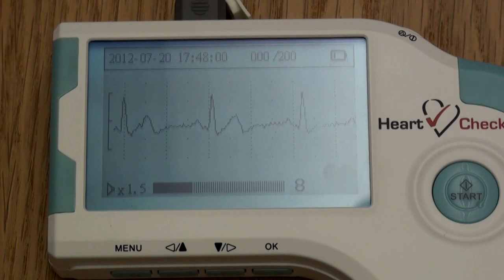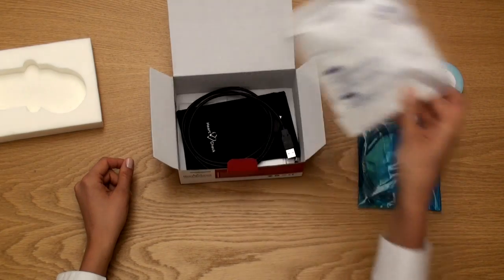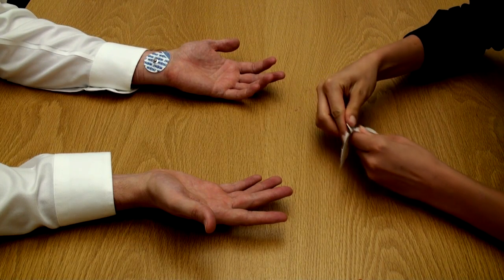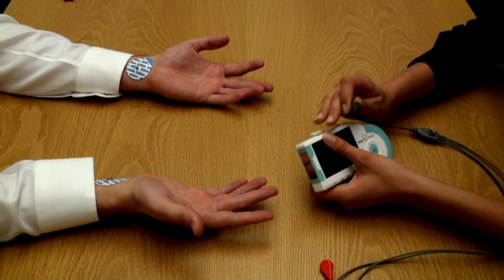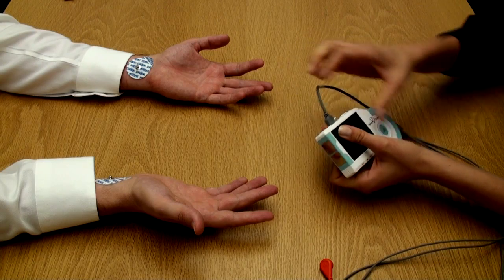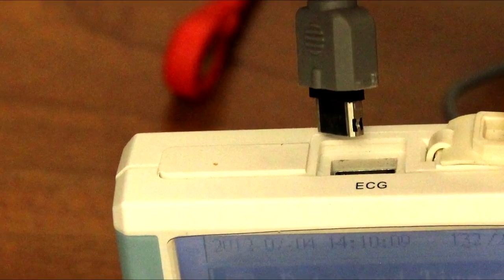Taking wrist measurements. There are several ways to take an ECG measurement using the HeartCheck handheld ECG device. For screening programs, the best approach is by starting with a wrist measurement. To take wrist measurements, you'll need to use the ECG lead wires and electrode patches included in the package. First, place an electrode patch on the patient's left wrist. Then, place another electrode on the patient's right wrist. Finally, place another electrode on the back of the patient's left hand. Once all the electrodes are in place, attach the ECG lead wires to the ECG port located at the top of the device.